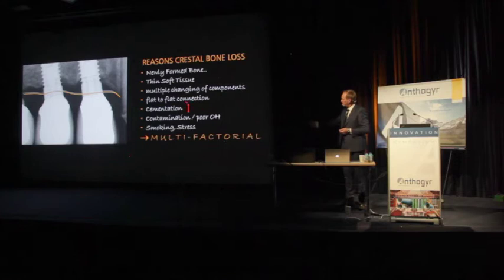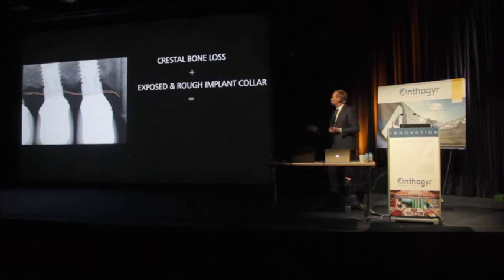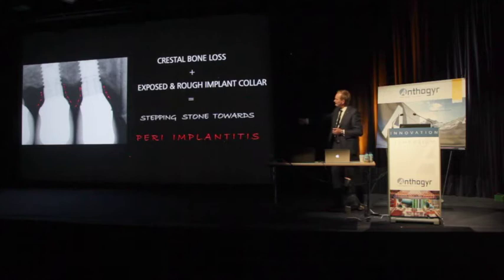But especially the connection and the contamination is a problem, because if we have crestal bone loss and an exposed rough part of the implant, the collar of the implant is outside of the bone, we can get infection along the emergence of the implant. And these are stepping stones towards peri-implantitis.